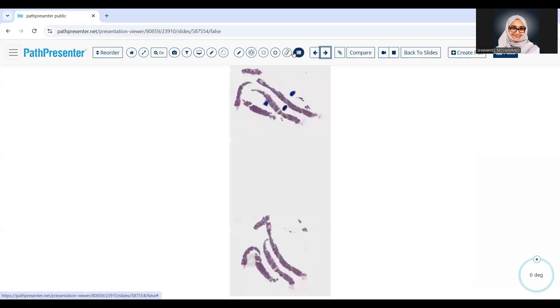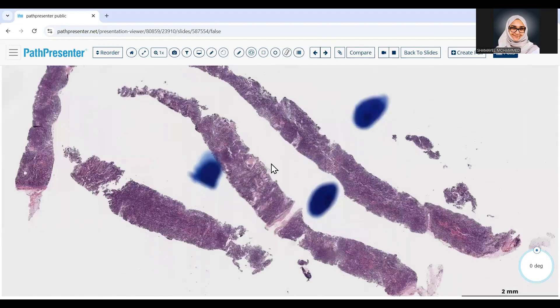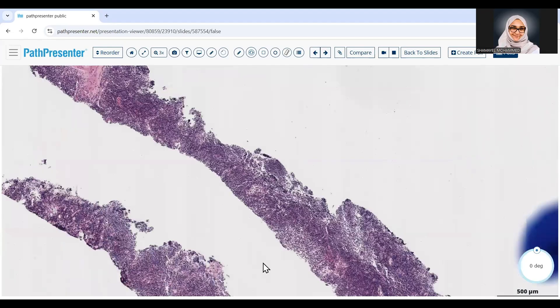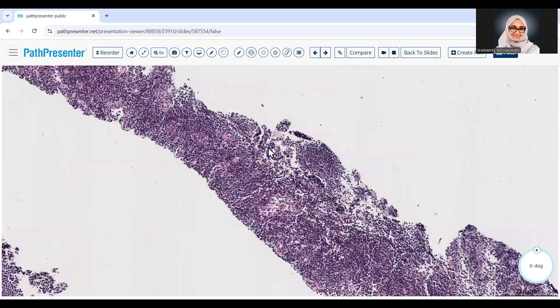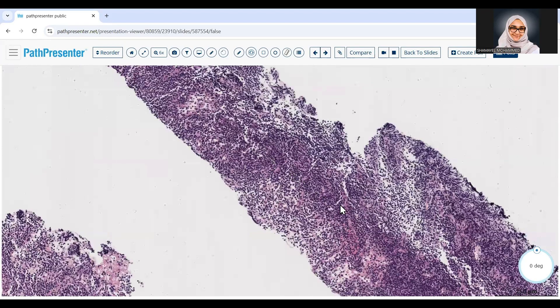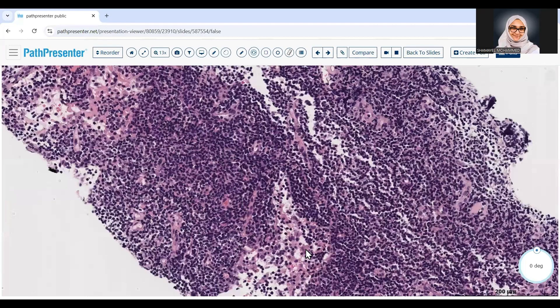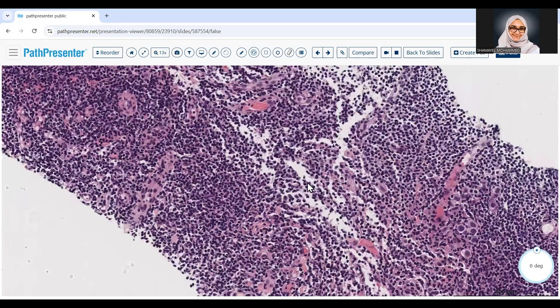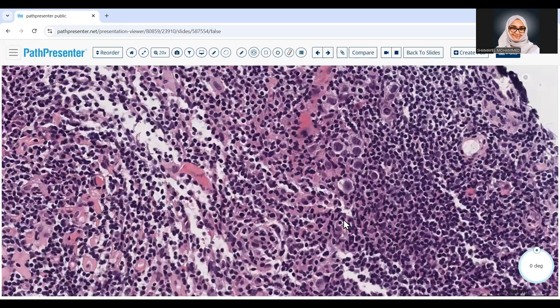Needle core biopsies were performed from this mass. As you can see, they give us good core biopsies and the cores are very blue, most likely lymphoid cells. Most of the core consists of a background of reactive-looking, bland lymphoid cells. There are some patent sinuses, and if you look closer, you start seeing aggregates of these larger cells — they are rare and they are sneaky.